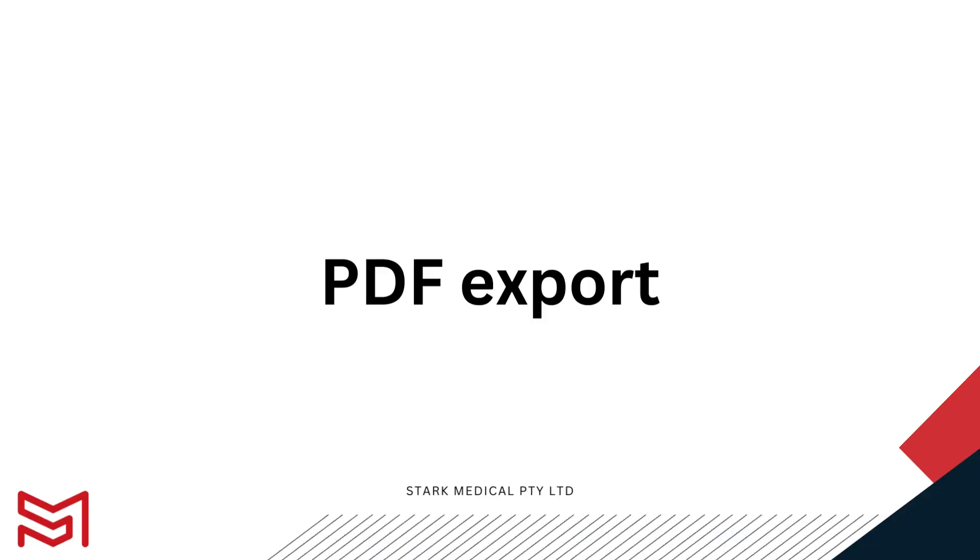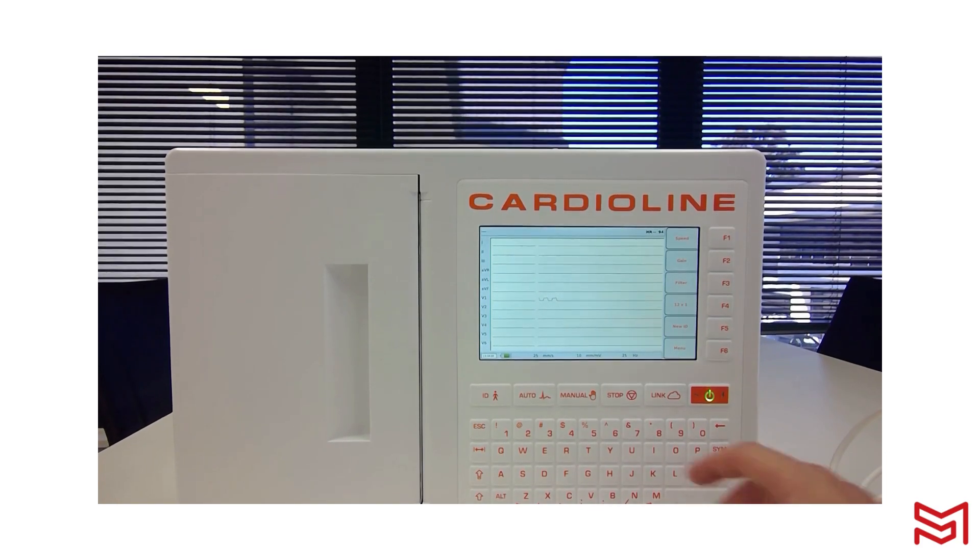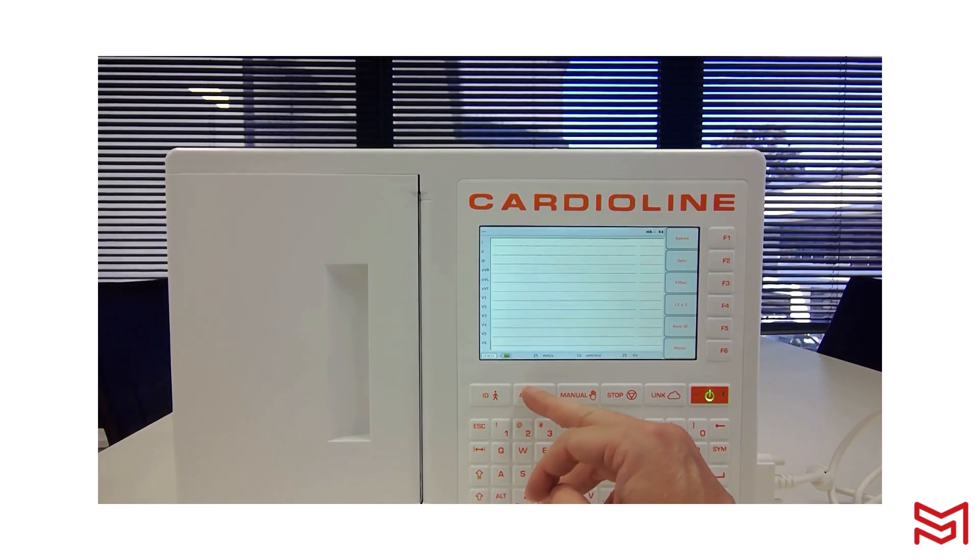Now that you've learned how to capture ECGs, let's work on exporting those PDFs. We're going to go through how to export a report onto a USB stick. We'll capture an ECG to demonstrate — I'll press Auto.